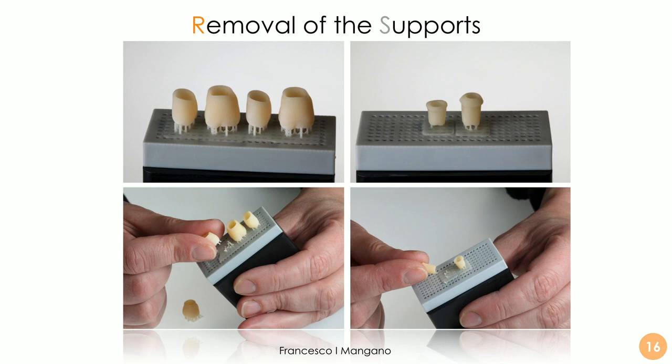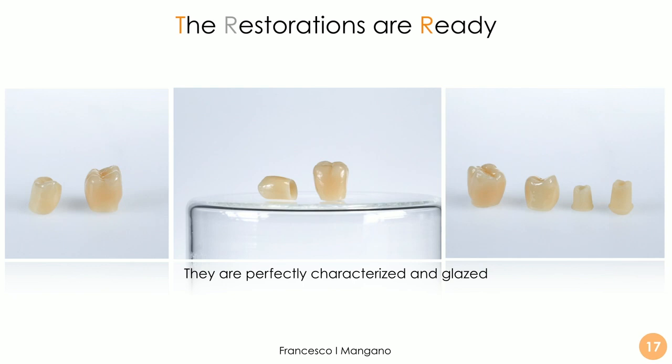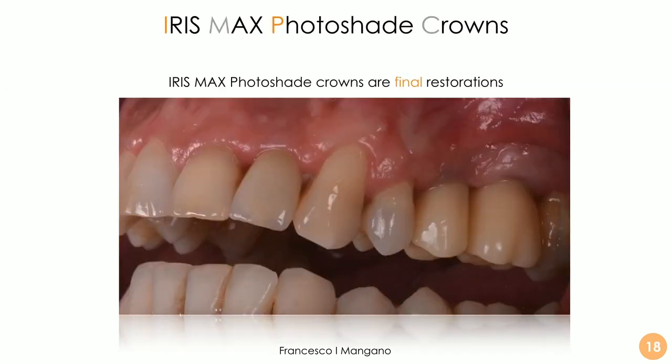We can characterize, glaze, and polish more or less as needed. The ability of the dental technician is still key, but with the photo shade technology we have three levels of color — very important for replicating the appearance in the patient's mouth. After characterization and glazing, these hybrid resin ceramic crowns look perfect and are ready for clinical application. The crowns and the individual hybrid abutments are then cemented extraorally over the titanium bases, screwed in, and the case is finalized with delivery of the Iris Max photo shade crowns as the final restoration.